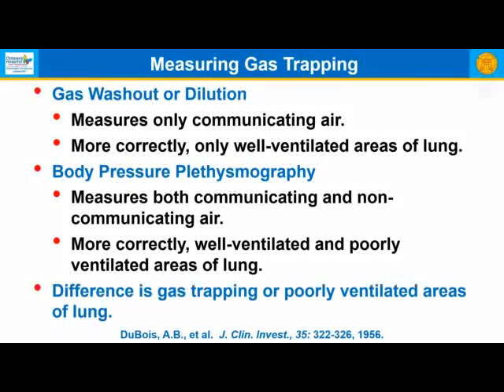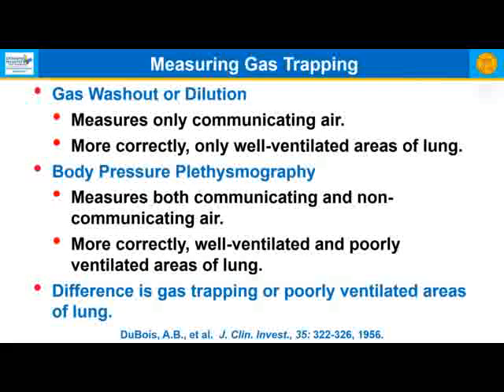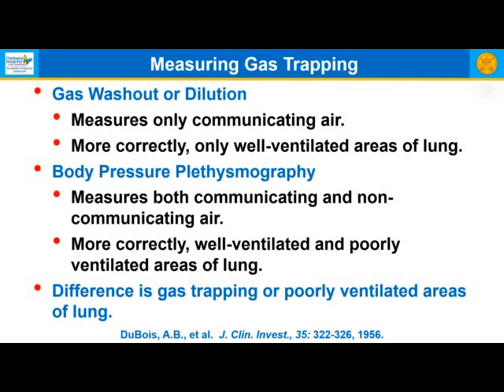Now, I will tell you, when I first started at Children's Hospital Los Angeles, we used to do both. We would do a helium dilution and a body box, and I was going to look at the difference between the two as a measure of gas trapping. The problem is that for most young children, being able to keep their mouth sealed around the mouthpiece for helium dilution was difficult. And the helium dilution value was often greater than the body box value, meaning that they'd had an air leak. So I finally gave up doing that simply because the times we could use the information was relatively infrequent. But in somebody who has good effort and ability, this is something potentially you could think about.